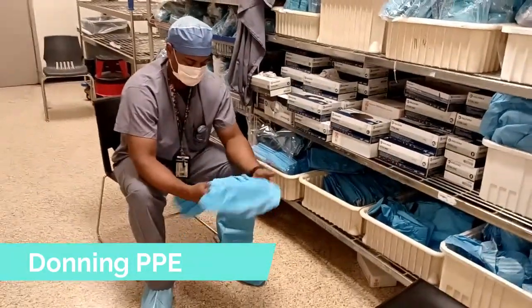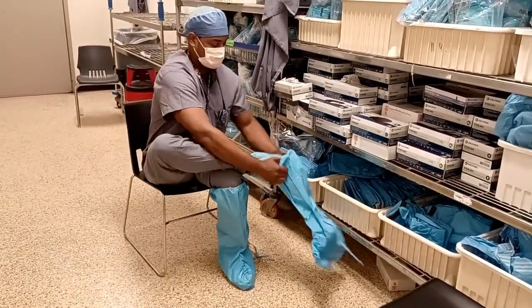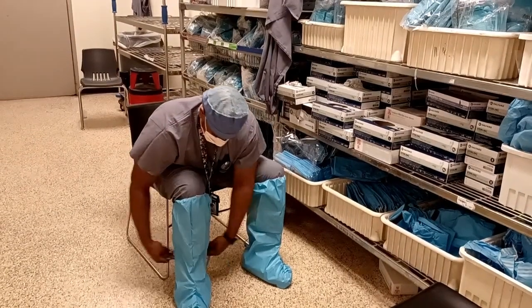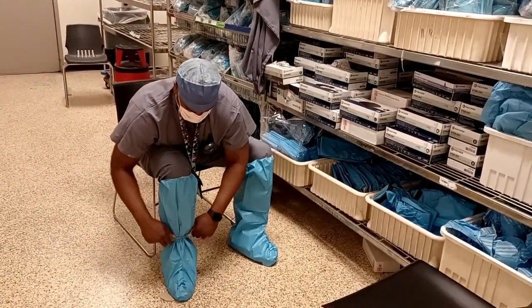Decontamination — donning PPE. You first want to apply your shoe covers and your boot covers. This will prevent slips and falls while in the decontamination room.